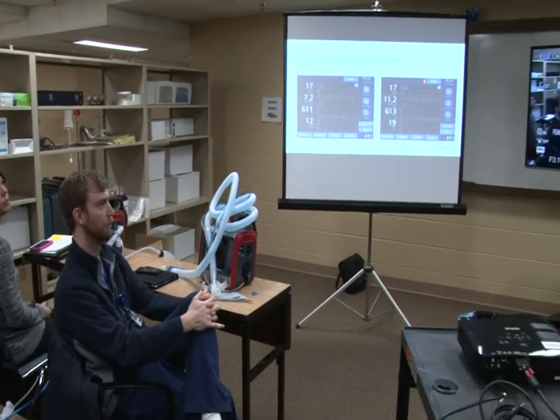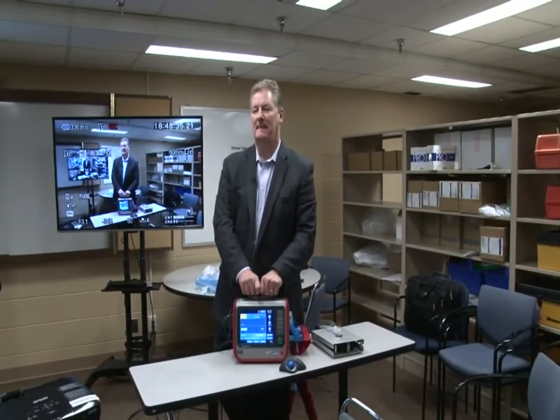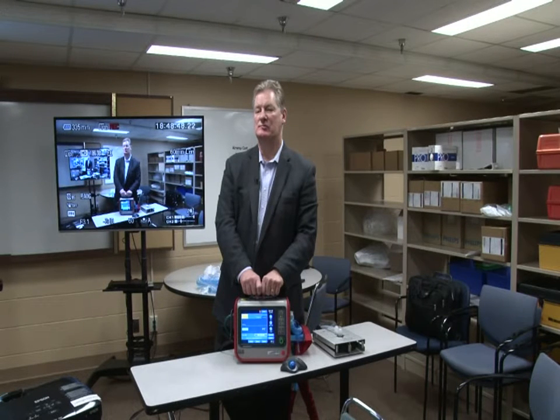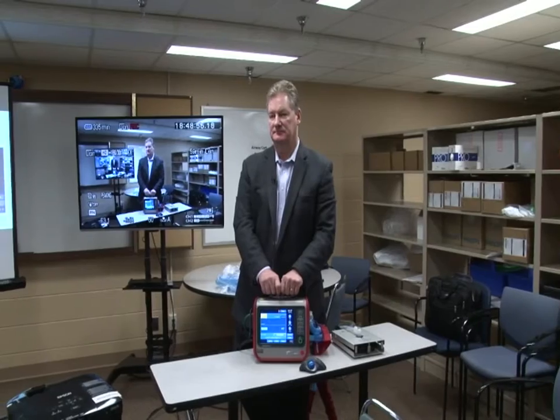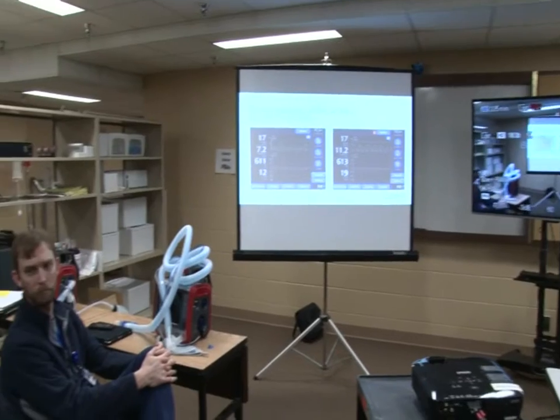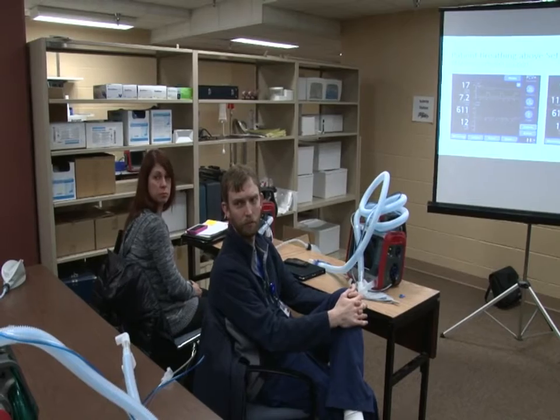That's really a yes, no, and maybe answer, in my opinion. If you're picking somebody up from Brian and taking them to Fort Wayne, and the pulmonologist says these are the settings I want, this machine will accomplish any setting that we want. If there's nobody, then my guess is we'll go to the ASV mode. If the pulmonologist calls us saying these are the settings I want for this patient in that uncontrolled environment, then we're going to set it up based on that, whether it's a controlled setting, a pressure setting, whatever. Otherwise, we'll do ASV.